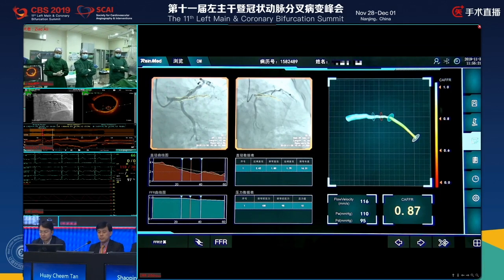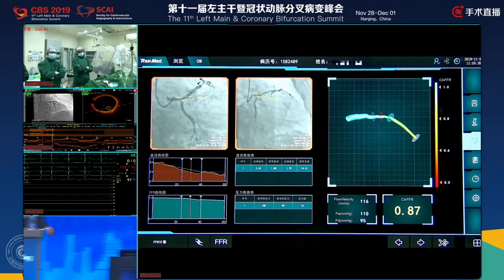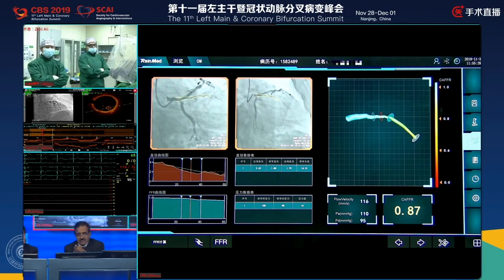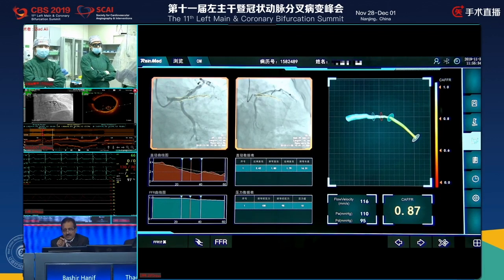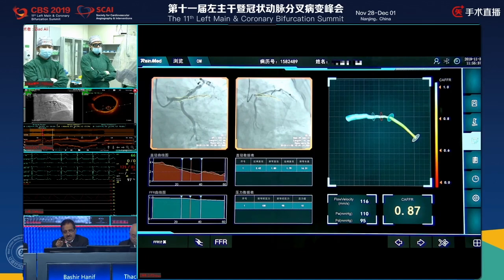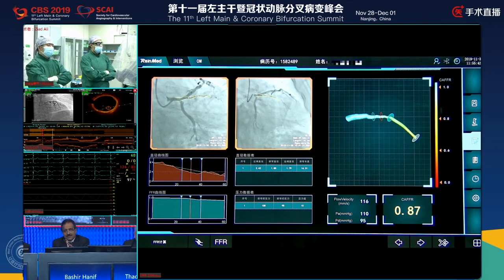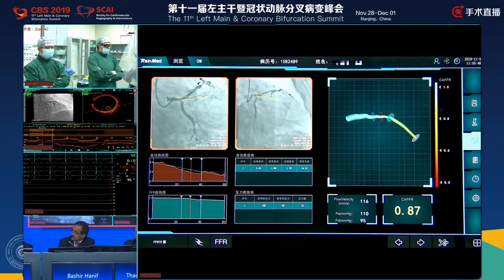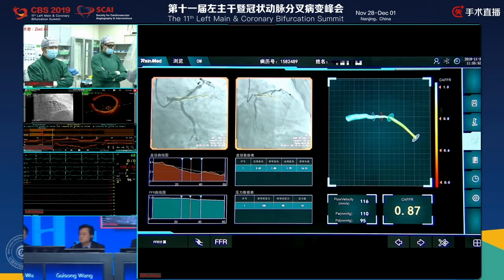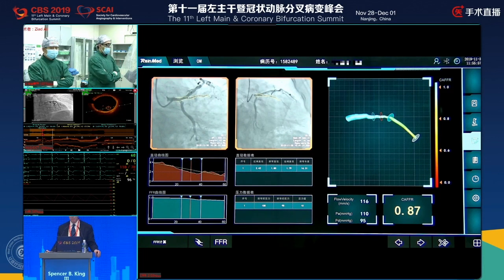We've done that. My only concern is we don't really have ECG changes, no troponin leak. We really don't know if the pain was cardiac. This septal may not be the cause, and if you try to intervene on the septal, you may actually cause problems to that LAD plaque in there also. So I'm not sure how beneficial it would be to do anything to this septal. So we're interested in the troponin. We're also interested in knowing what the LAD looks like with more definition with the intravascular imaging, with the OCT. So we can show you that, Spencer.